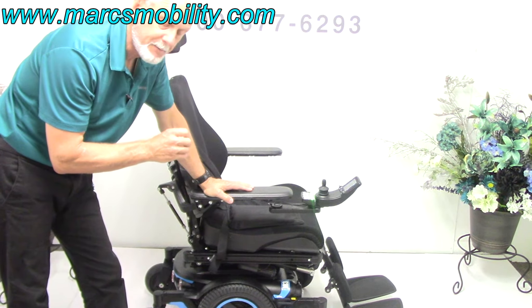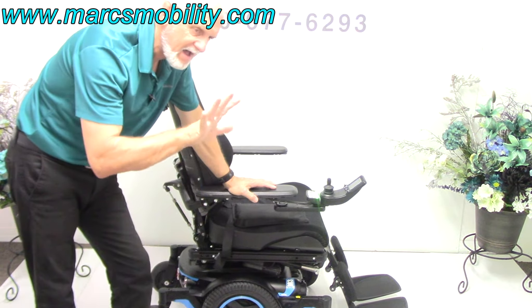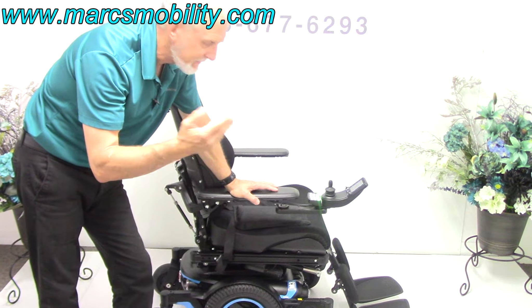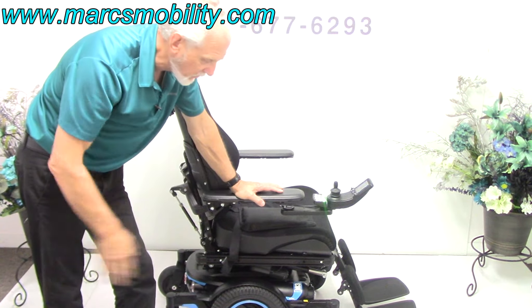This is a Permobil M3 power chair — top of the line. This chair has five electric functions and it's fully loaded. It has only one mile on the meter, so this chair was delivered and never used. You'll maybe have two miles on it by the time you get it.